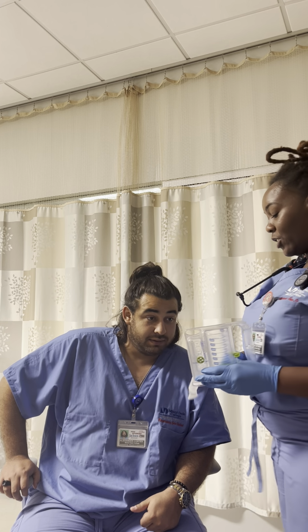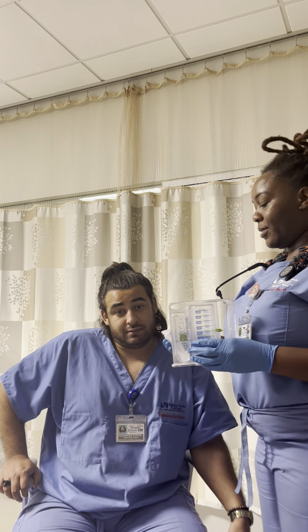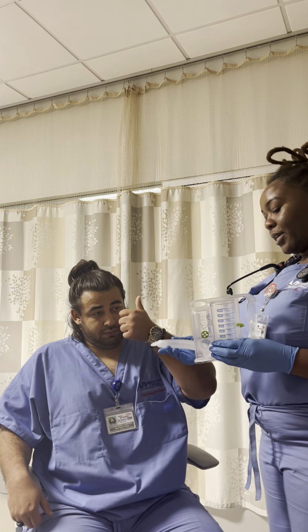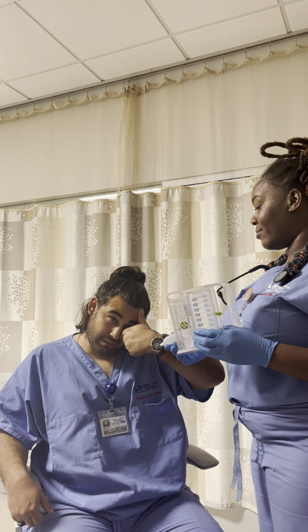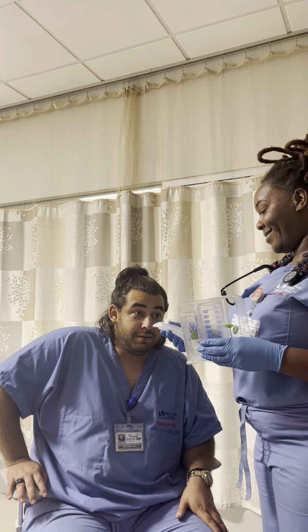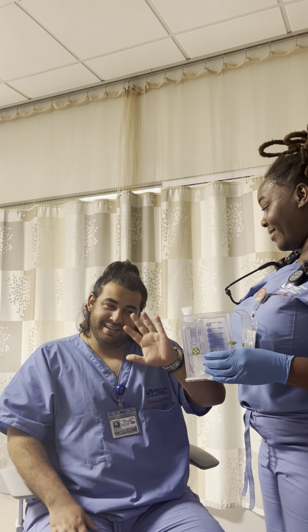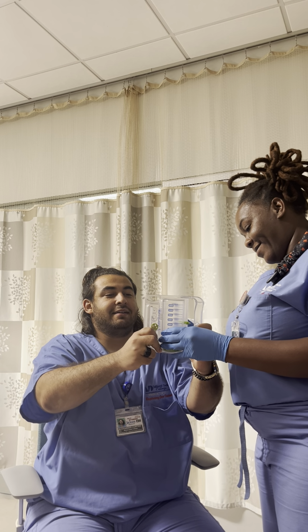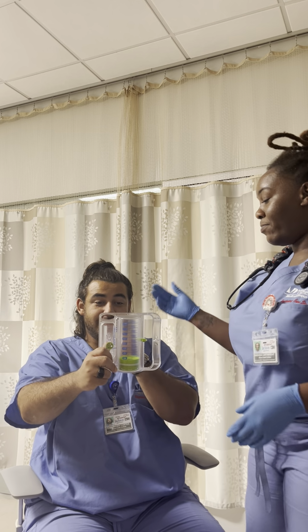Okay, so as I instructed you before, go ahead and after a normal breath, after a normal exhalation, that's when you put your lip around the piston, around the mouthpiece. Don't block. Hold it upright. Patient will hold this upright, okay? Patient sitting up.